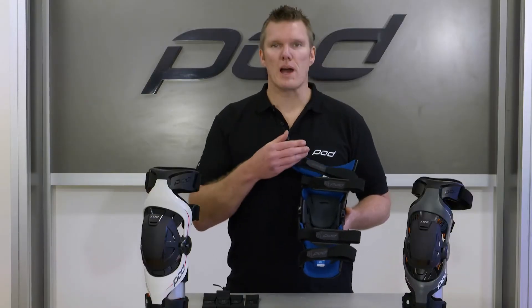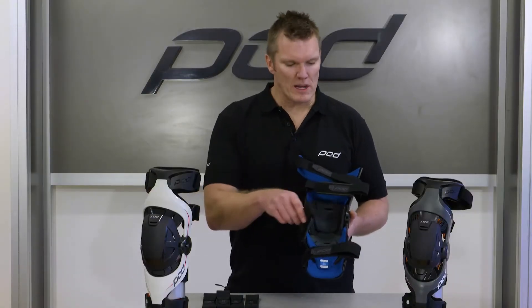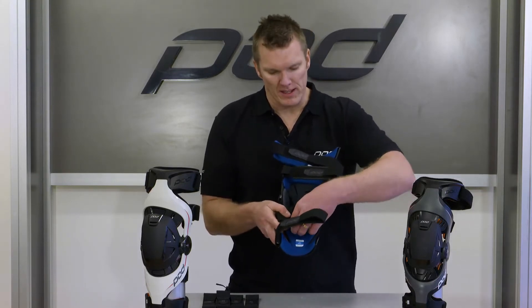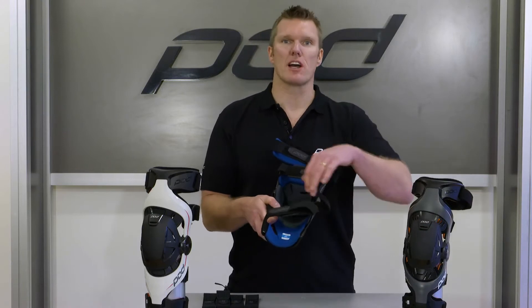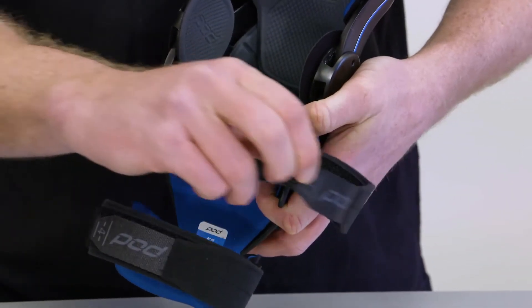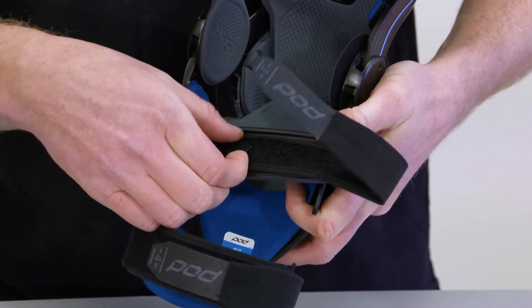All four of your straps function identically. Once you've undone them all, I'll replace strap number one here today. The important thing to note is that the straps are adjustable in length, meaning the numbered component is what you adjust when you're putting the braces on and off.